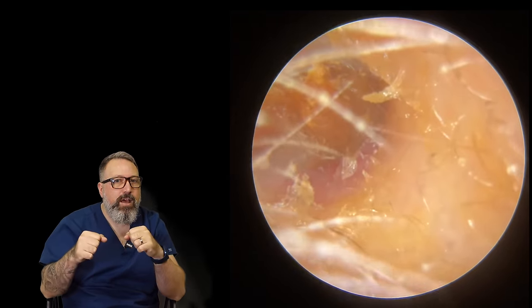There we go - out, that's all coming. Let's take a look beyond - let's have a look at the eardrum. Looking nice and healthy there, that eardrum. No issues there whatsoever. So this is what we will - two and a half centimetres, one inch worth of ear wax there.